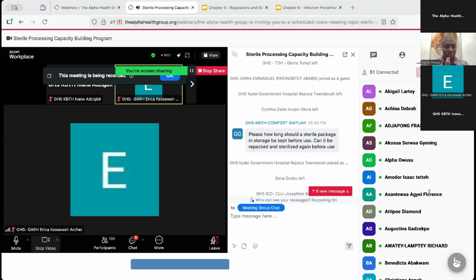What does event related mean? When the instrument gets soiled, it gets moist, it gets dirty, it gets a hole on the instrument, or the tamper locks get broken, then it is event related. It has got to be reprocessed. Other than that, we can come up with one as our pilot project.